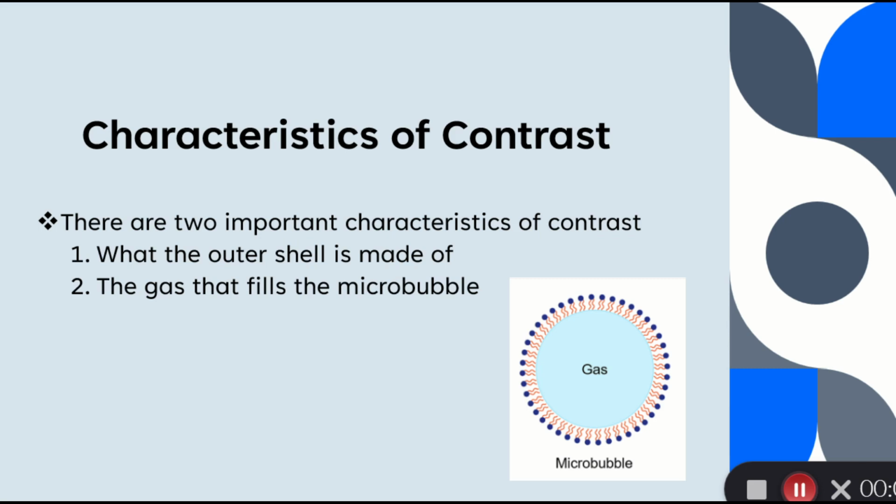Secondly, what gas is filled in the microbubble is important. The gas inside of the shell determines the stability of the microbubble. Small gas molecules may leak out of the shell, whereas large gas molecules may never dissolve.